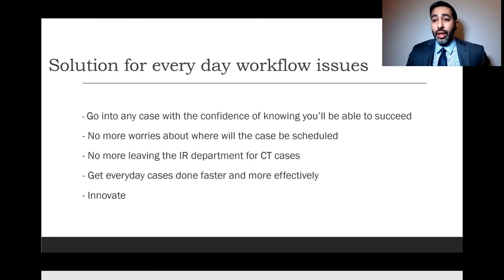Or we had another case, metastatic cholangiocarcinoma, previous CBD stenting, comes into the hospital with infection and has a progression of disease with an isolated duct within the superior right hepatic lobe, single duct, infected duct, needed to be targeted, can't see with the ultrasound, can't get to it fluoroscopically, switch over to CT, get your access, and then come right back into angiography and get that stent in without any complication.